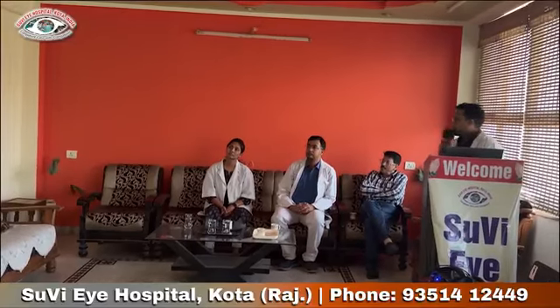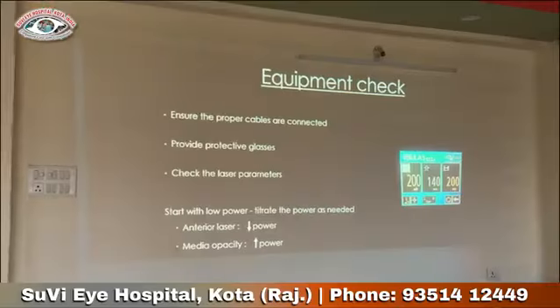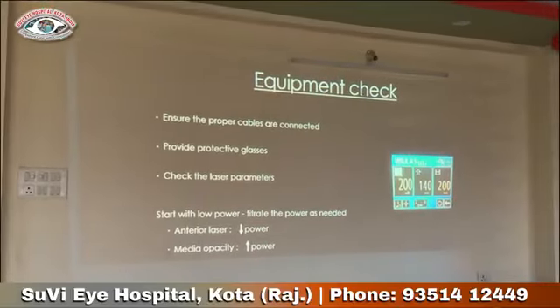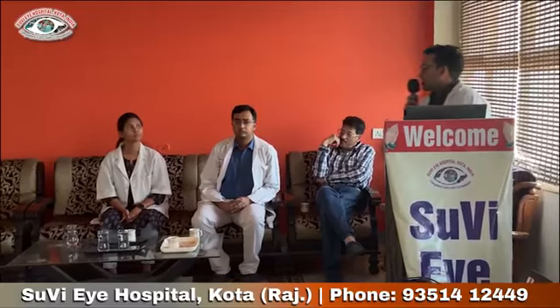Protective glasses are present in the laser room. Check and then titrate as needed. If you go more anterior, we decrease the power, and if it's the opposite, we increase the power, according to the grades of the burn.